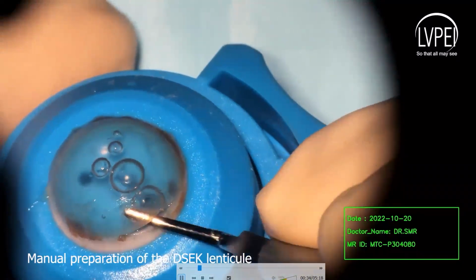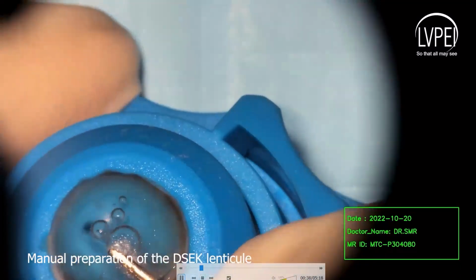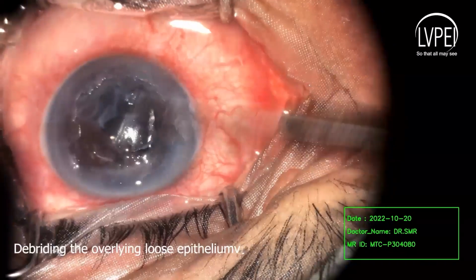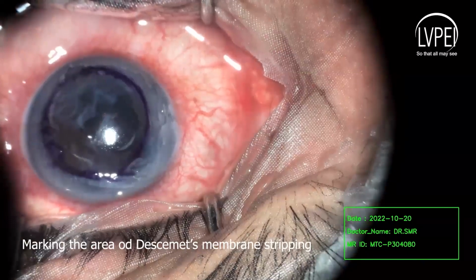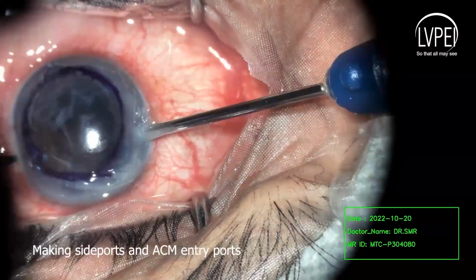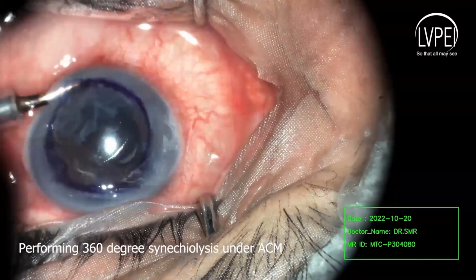The lenticule was manually prepared using an artificial anterior chamber, a 400 micron guarded knife, and a pair of short and long lamellar dissectors. The central 8 mm of the host corneal epithelium was debrided for better visibility. The periphery was avoided. The area of the Descemet membrane stripping was marked. Side ports were made for instruments and for placing the anterior chamber maintainer.